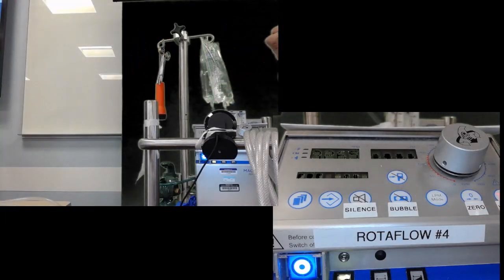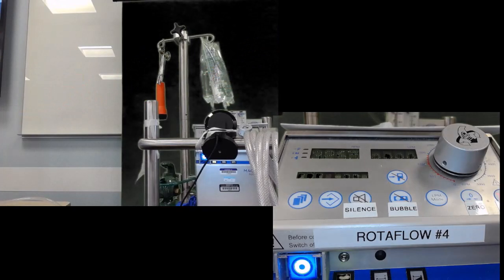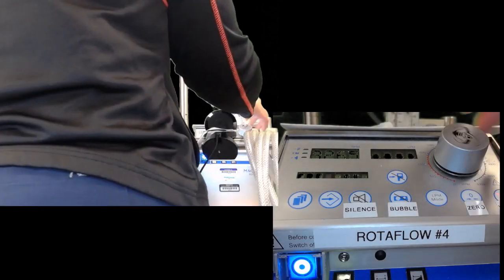Always look before you clamp. Occasionally people have scissors hanging on there, which is useful. Very good. And then you can come over here and turn it off. So you see that the flow is 0, and good, you clamp it off.